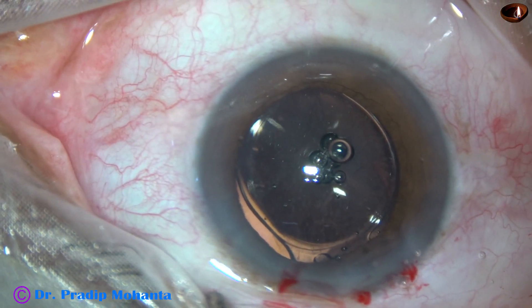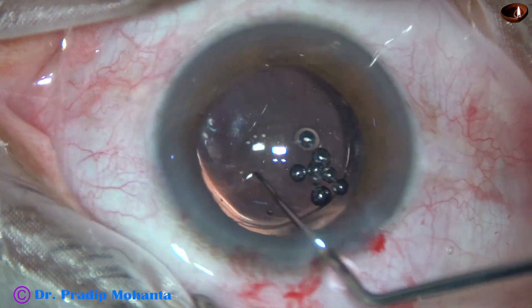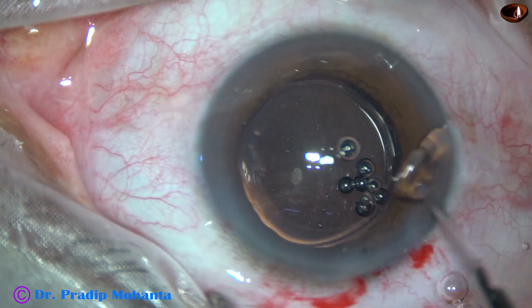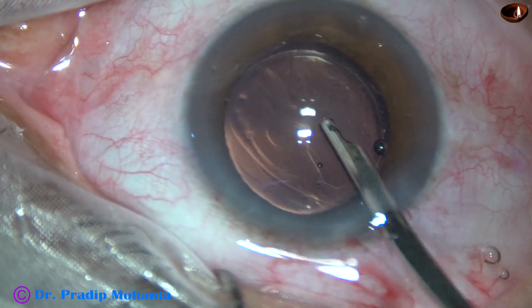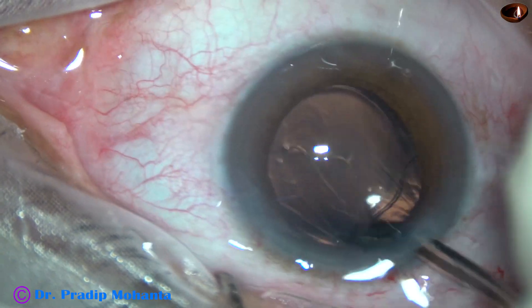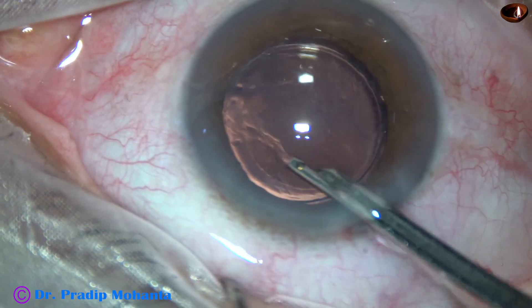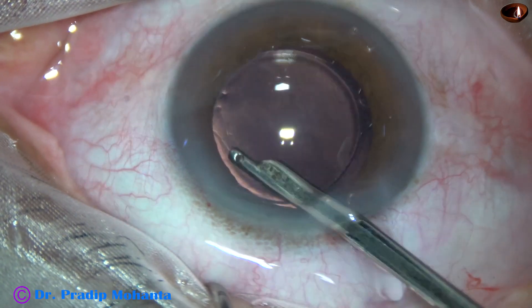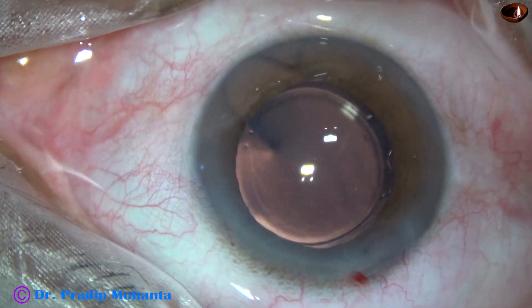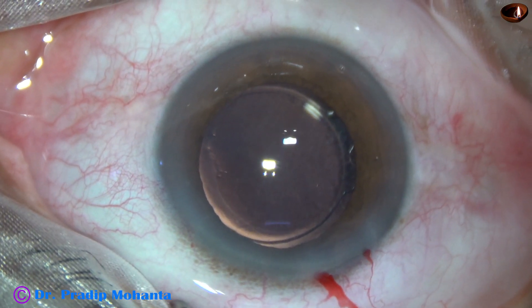In this case I have noted fine white dots on the posterior capsule, all over the posterior capsule. I am going to show that in higher magnification at the end of this video. I don't know what kind of deposit this is, and probably this will not cause much hindrance in visual gain. But if it does cause some hindrance, we can always do YAG laser posterior capsulotomy.